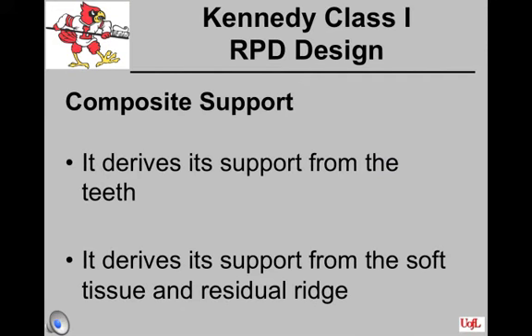The Kennedy Class 1 partial exhibits composite support. By that, we mean that it derives its support from the teeth and it derives its support from the soft tissues and residual ridge beneath it.